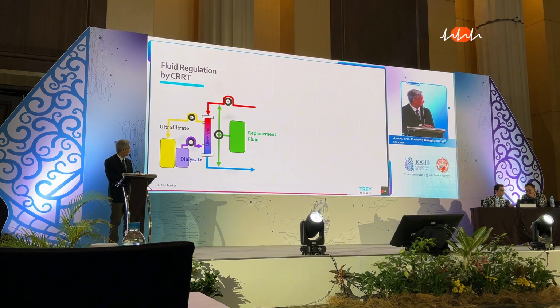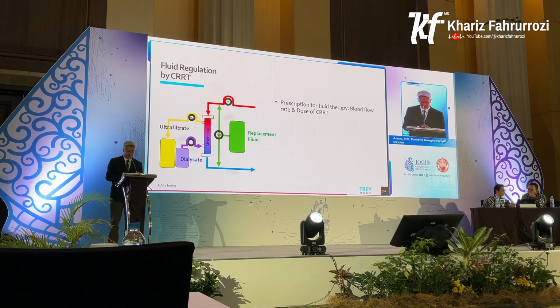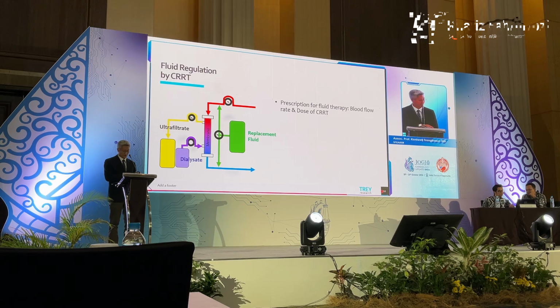For the convection therapy, we should focus on this fluid, which is replacement fluid, where it can be infused into the patient via pre-membrane and post-membrane. In terms of fluid regulation, we need to focus on two things. The first one is the blood flow rate of CRRT, and the second thing, we need to focus on the dose of CRRT as well, if you want to remove the solute, similar to renal function.